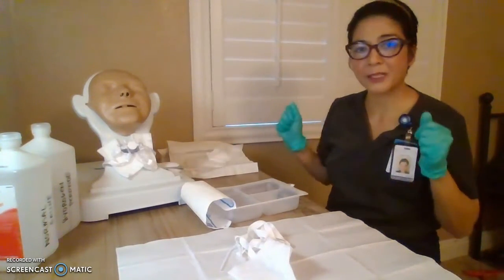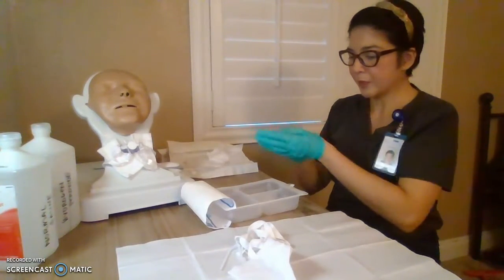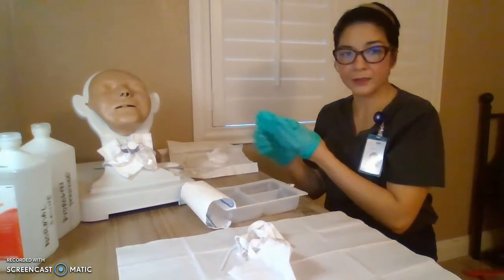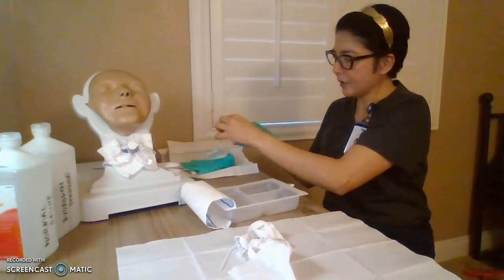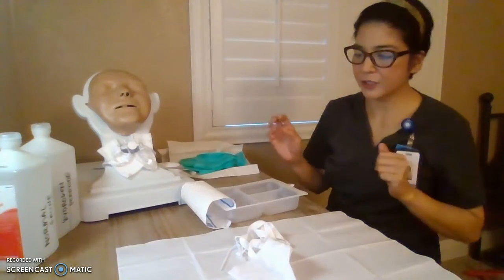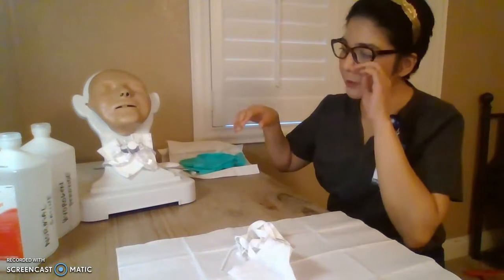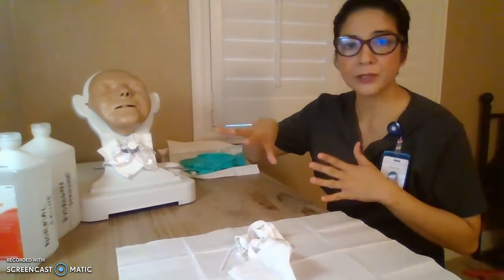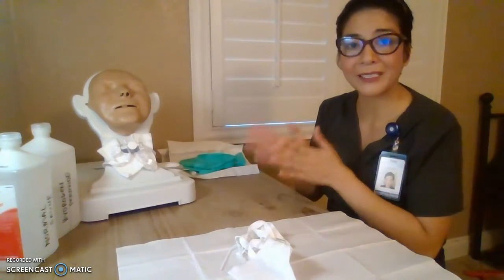Okay, so now we're set up like that. All right, so we're done with the sterile procedure. We're now discarding this. Okay. So at this moment, check your patient again, talk to your patient, discard everything. We are done with that. So I just want to inform you, that's why we still have our ties. We are doing this by ourselves. We are not removing the ties, so we have to make sure that the trach is intact.